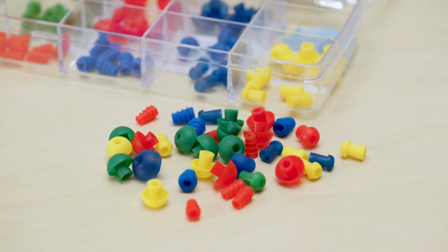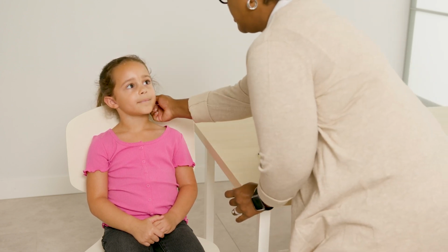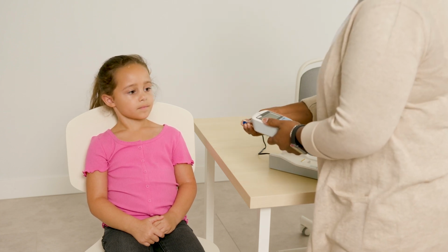Here are a few steps that you should take before performing tympanometry with each child. Take a moment to inspect the child's outer ear and ear canal. With a smile on your face, mention to the child that you need to take a quick look at each of their ears. Make note of anything unusual or unexpected, such as growths, evidence of injury, atypical shape or position of the outer ear, small pits in the skin, or skin tags in front of the ear.